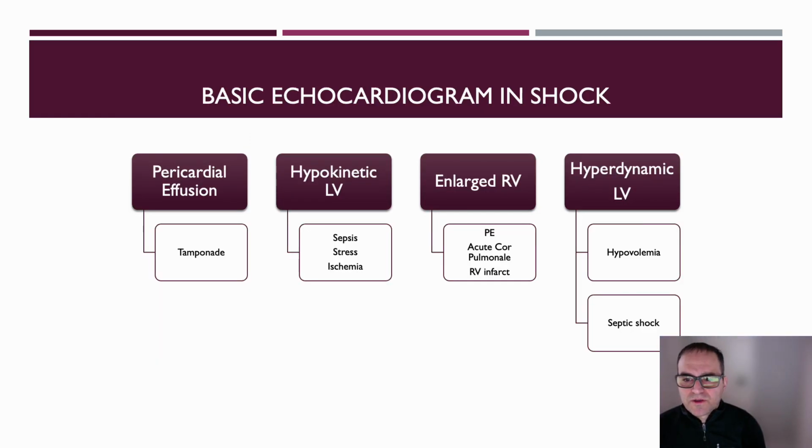POCUS is an essential diagnostic and management tool in patients with shock, respiratory failure, and cardiac arrest. Basic echocardiography allows you to evaluate LV and RV systolic function, pericardium, and IVC. I truly believe echocardiography and ultrasound is one of the best tools you can learn as a clinician, especially if you take care of patients with hypotension, shock, respiratory failure, and for volume status evaluation.